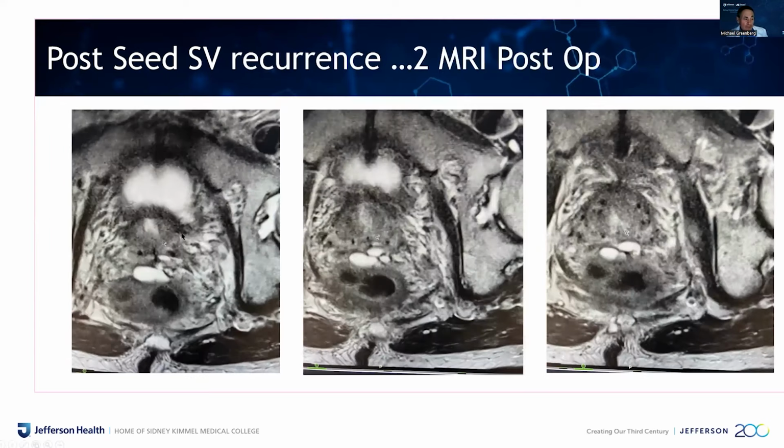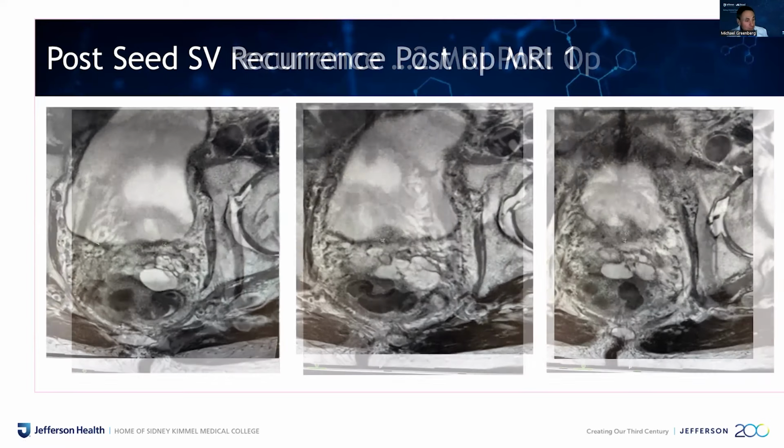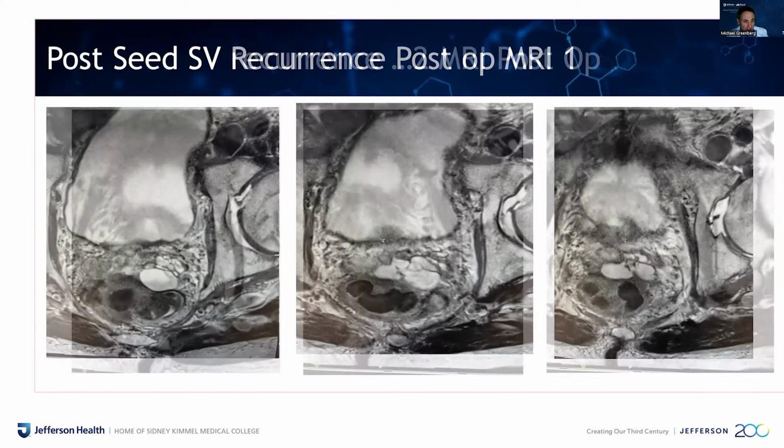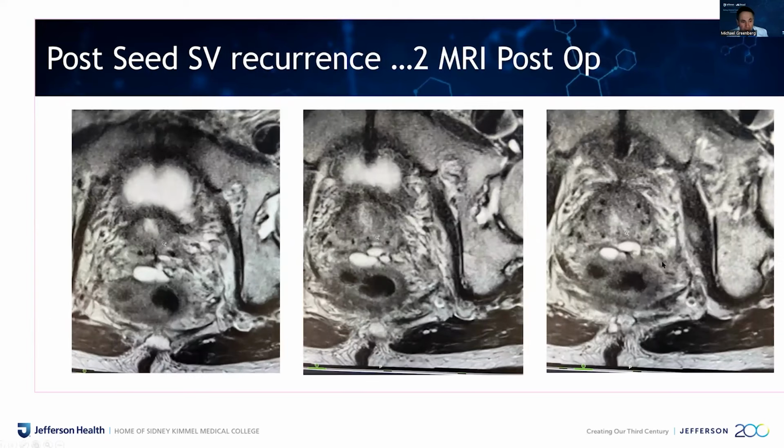And now we're down to the lower portion of the apex of the prostate, and we still have a good amount of gel, and you can see the black dots, and those are the seeds. So we got very good placement from top where the target is all the way down to protect the lower portion of the rectum, even though we're really just treating a very small target.